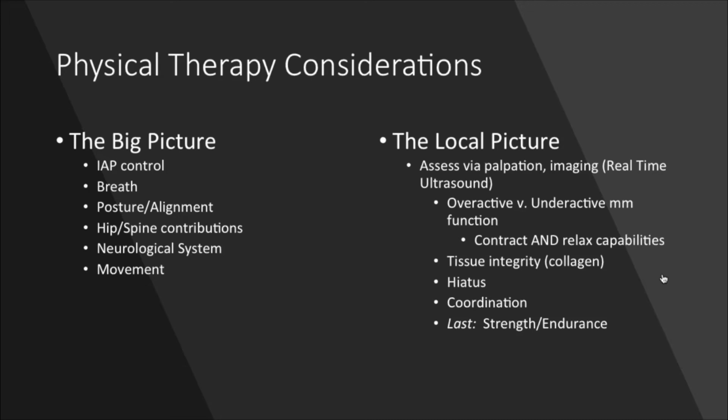That's really where you have to pull together that entire clinical picture and coordinate with any other imaging. The imaging findings have to correlate with what the patient's subjective has revealed and any other findings that you have. So imaging alone doesn't necessarily, in this particular case, give us the full picture. We need to coordinate it with the rest of the exam.